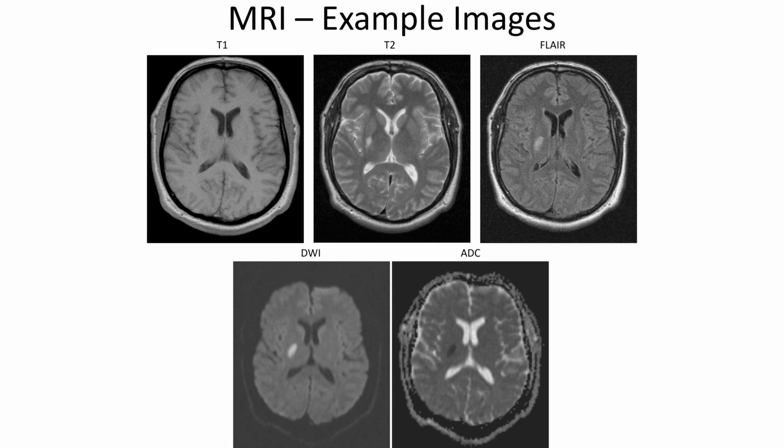You can see on the T2 image, everything looks kind of inverted. The cerebral spinal fluid, the water, is white. In fact, I always remember T2. For some reason, this is stuck in my head. 2 is spelled TWO. The water is white. You can remember the W in it. Water is white. That's a fundamental characteristic of T2 images. Also, the cortex is inverted here. The cortex looks white. The white matter looks darker. And you can see that on all of these, the bone doesn't respond very well to MRI. It doesn't give much of a signal.